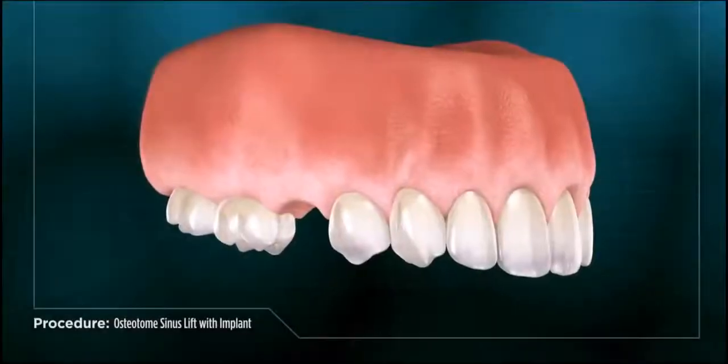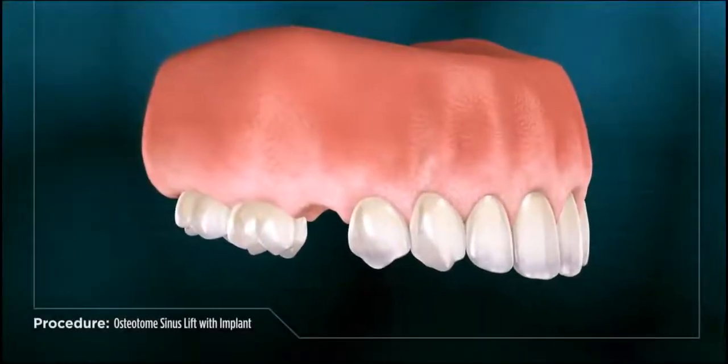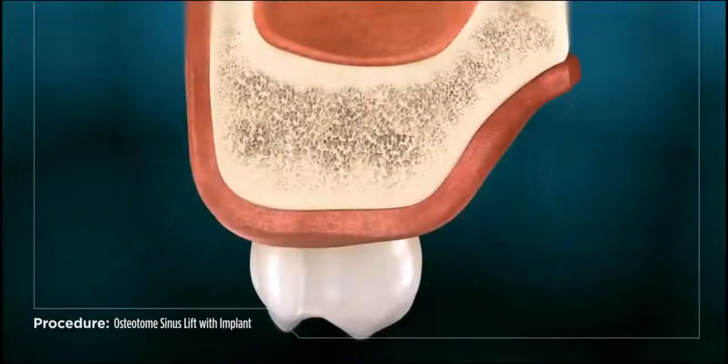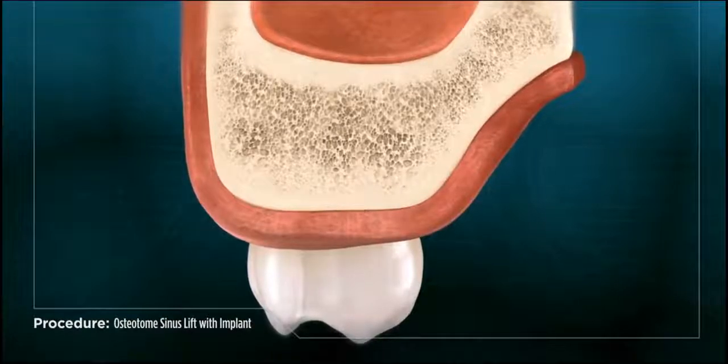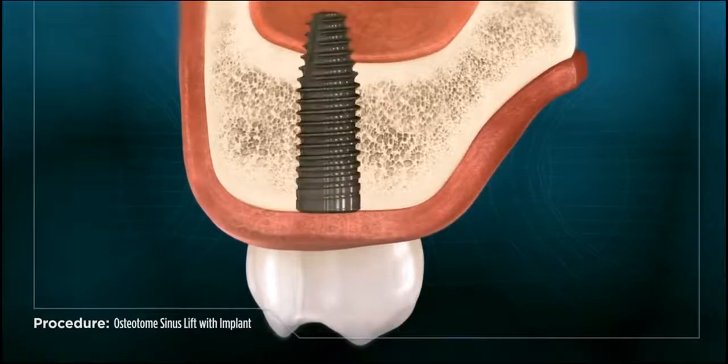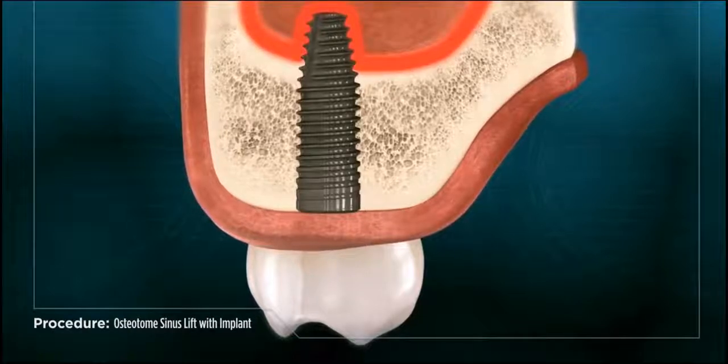When a tooth is missing in the upper rear portion of the mouth, sometimes there is not enough bone available to support a dental implant. Were an implant to be placed, the sinus pocket around the diminished bone could be damaged.